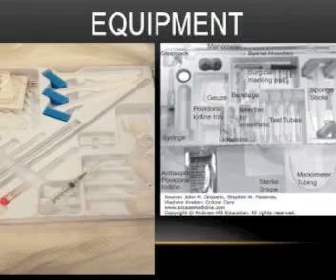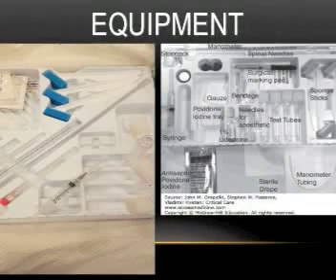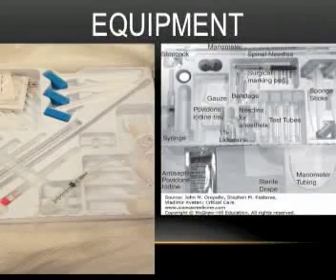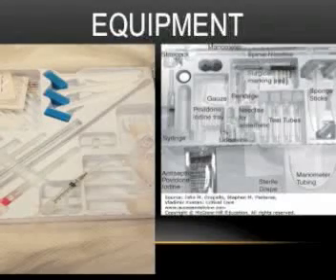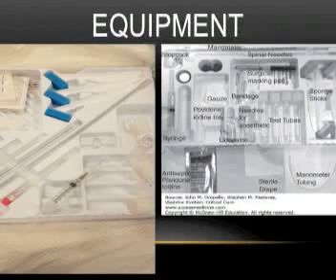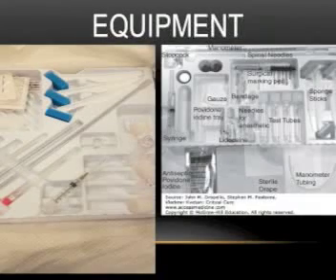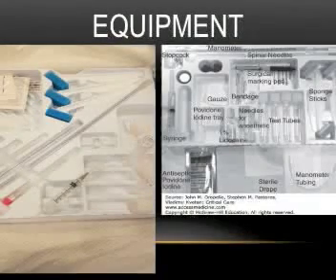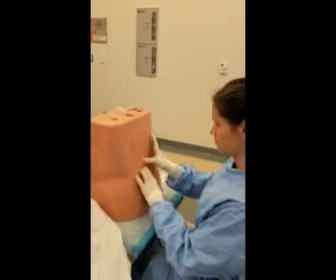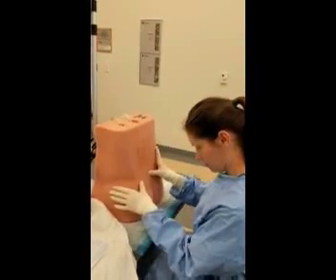And now we will walk through a quick demo. As stated, begin by locating the iliac crest and finding L4. Mark the location either between L4 and L5 or L4 and L3.